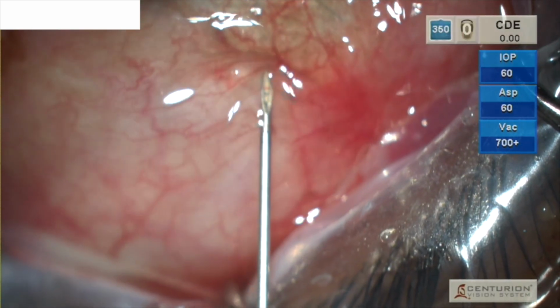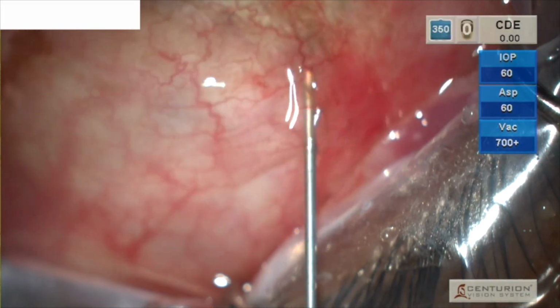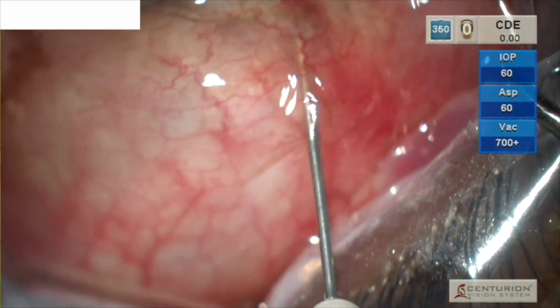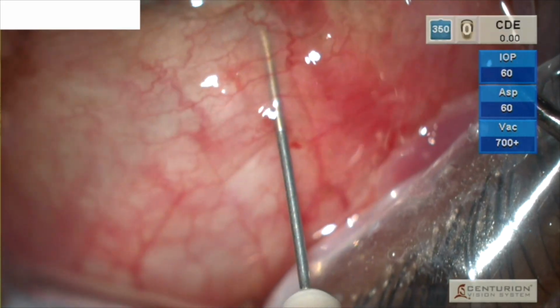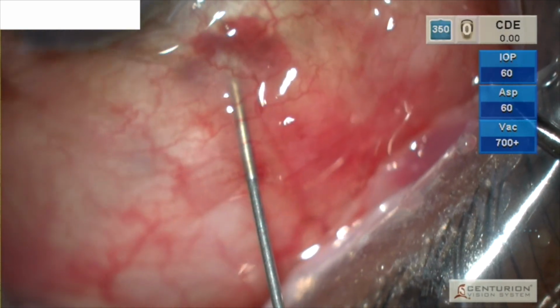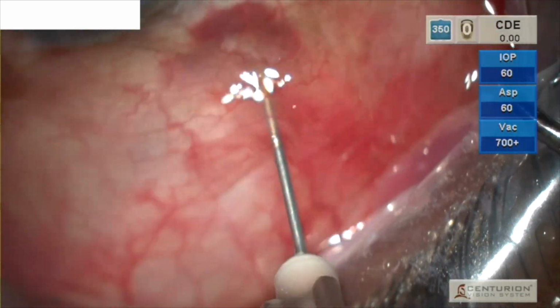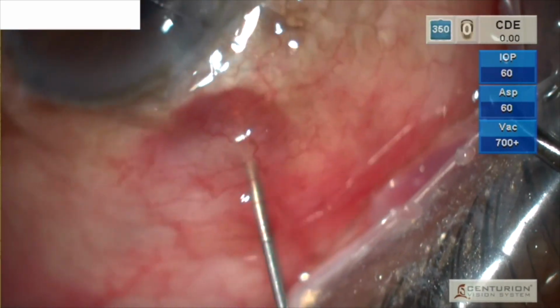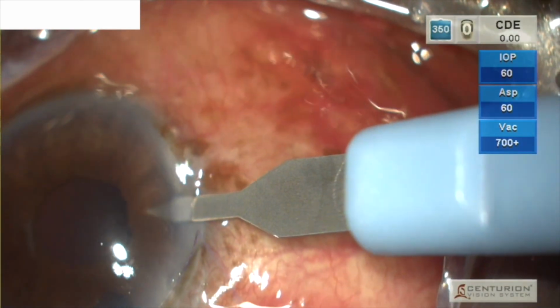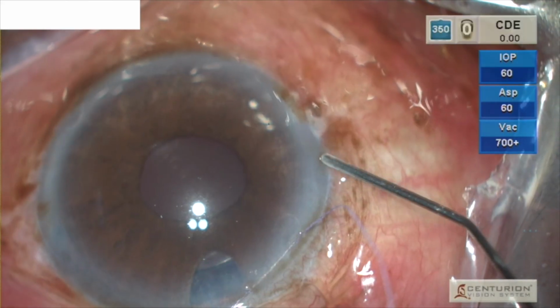The needle with bevel up is introduced subconjunctivally 4 to 5 mm away from the bleb site. The needle is carefully moved side to side, breaking the episcleral adhesions until the bleb is reformed. A small paracentesis entry is made, and the anterior chamber and bleb are reformed.